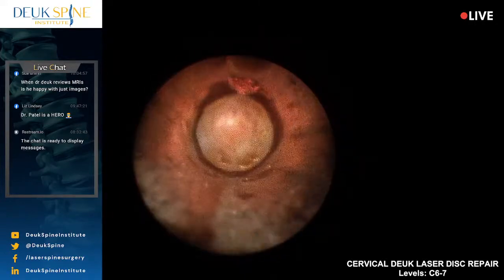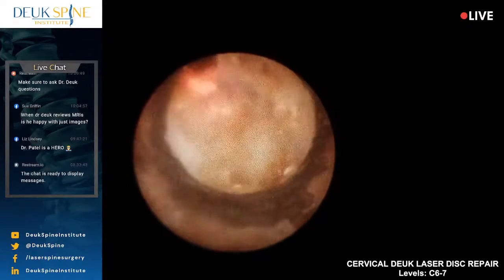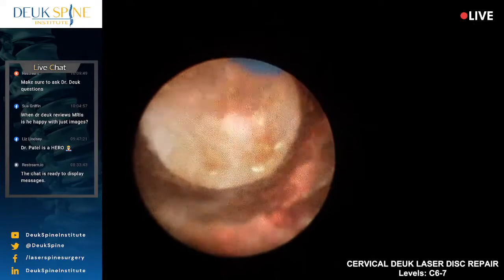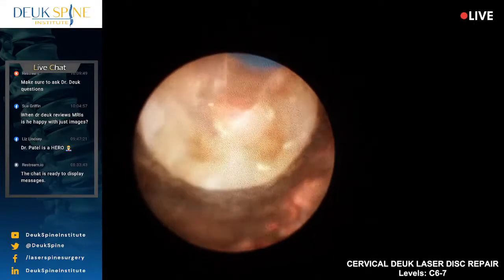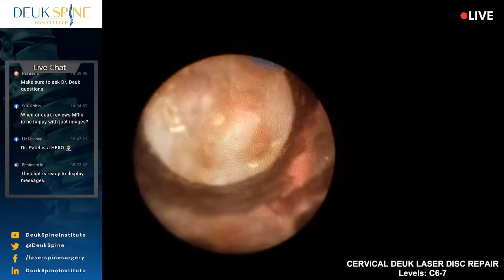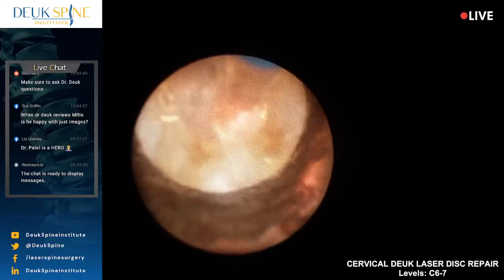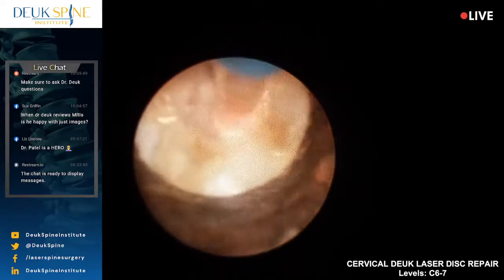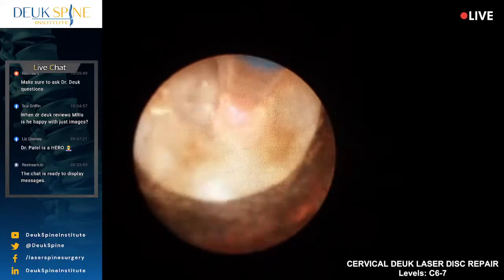That's good, guys. I don't need that any closer. You can see the herniation here. The laser's literally peeling it off. And there's not a lot of movement of the disc right in the beginning, but there will be more later once we use the laser to free up and debride the annular tear. We're going to free up the segment.